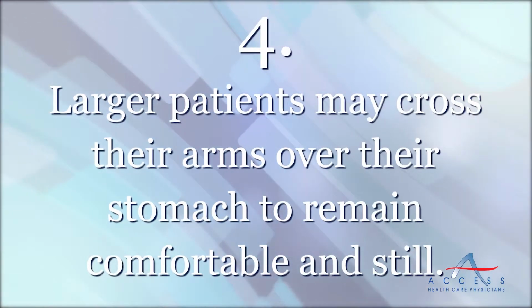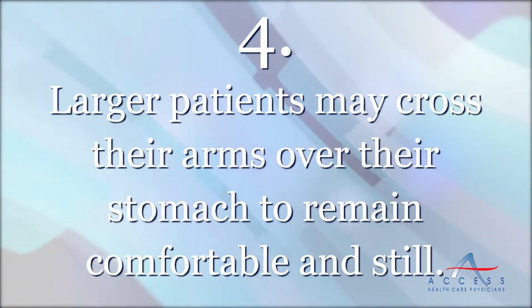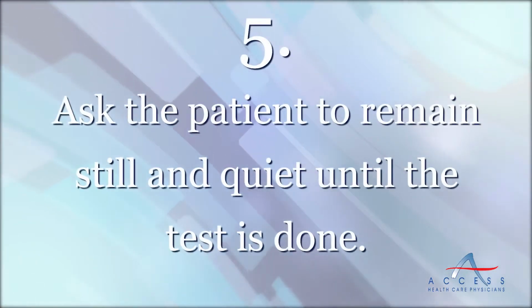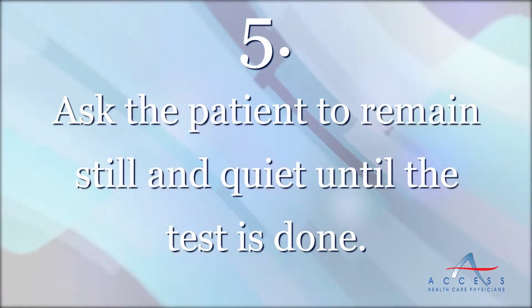4. For patients that do not fit comfortably on the bed or exam table due to size, ask them to cross their arms over their stomach to reduce muscle tension and movement. 5. Ask the patient to lie still and quietly until the test is done.